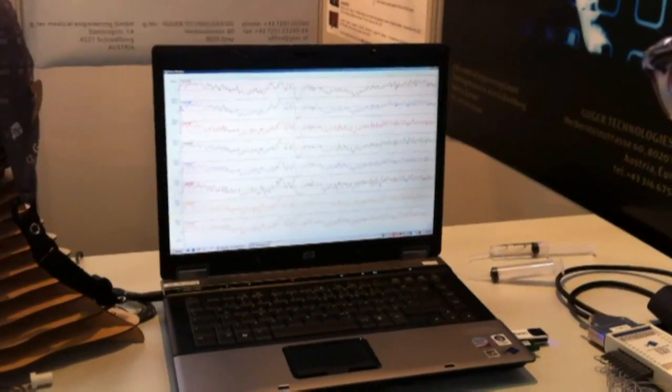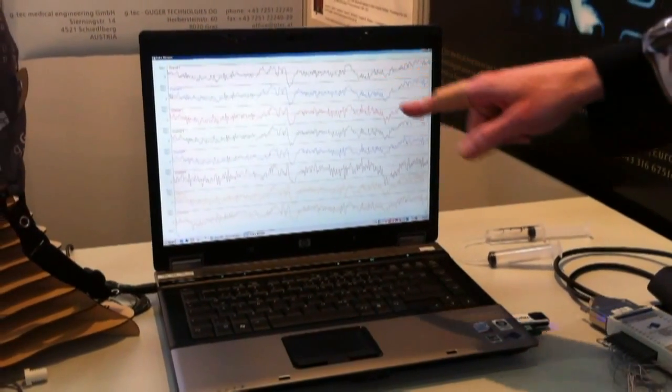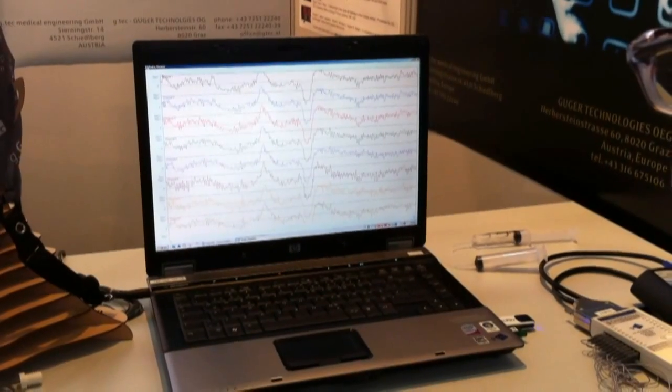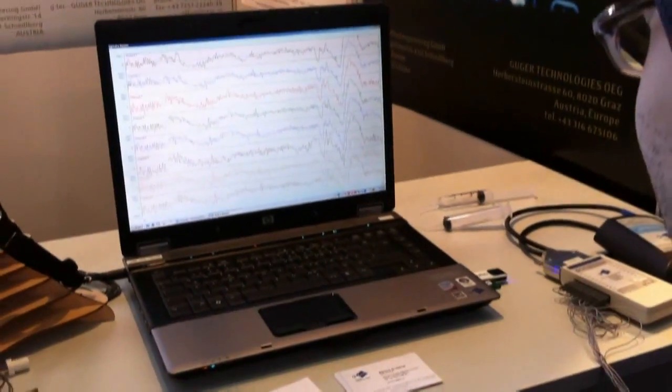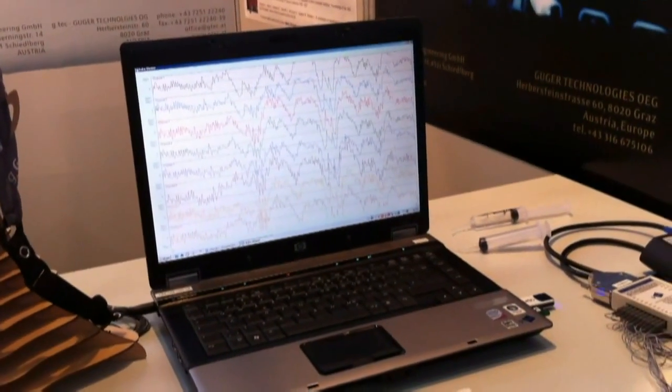Do I look healthy? It looks good. For instance, when you blink with your eyes, you have all these artifacts in the EEG. That's wild! I've never seen my brain activity printed out in front of me.